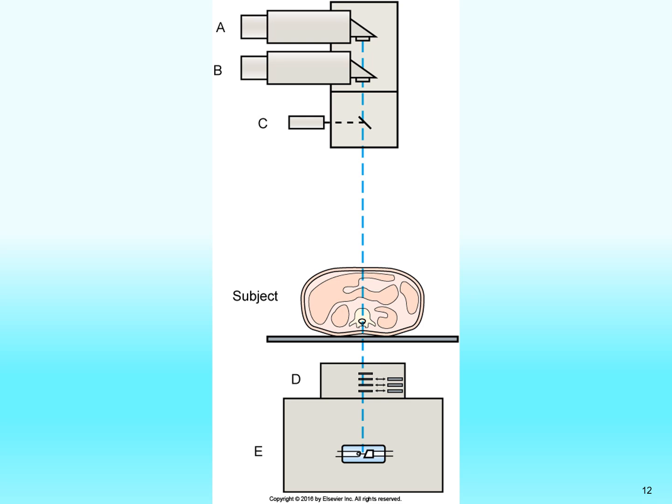Letter C is a laser and a targeting mirror that is radiolucent. Okay. So we can see the laser beam would strike the patient's abdomen, and that's going to model where the X-ray beam is going to exit the patient from inside the table. And so we can use the laser beam and the 45-degree angle mirror to center the patient appropriately for the measurement.